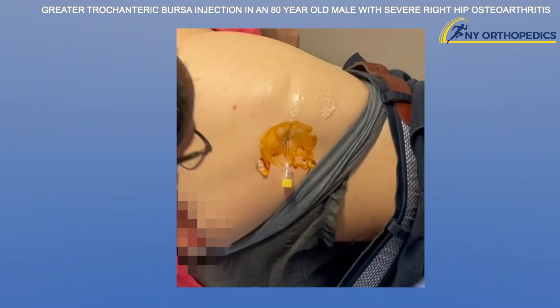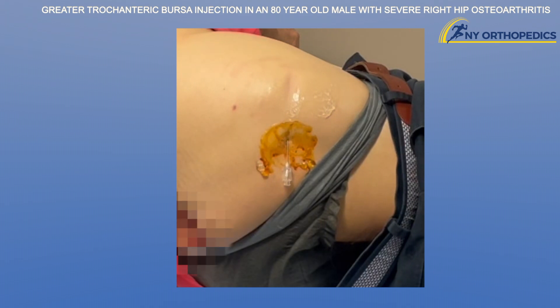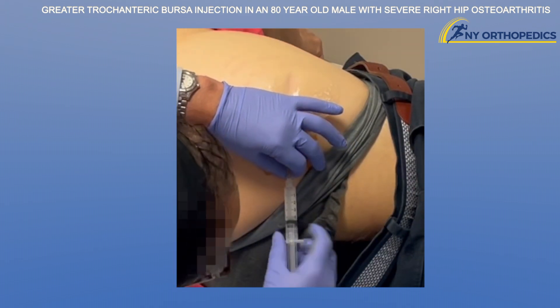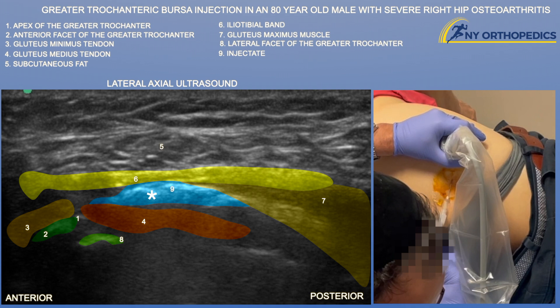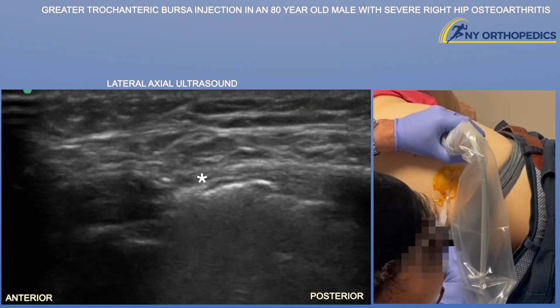It might be a little bit in the gluteus medius tendon itself. Now we're pulling out the stylet and attaching our cortisone — this is mostly saline, about three or four cc's of saline mixed with about 10 milligrams of triamcinolone. Here you can see that flash where you can see the injectate overlying the gluteus medius tendon and pushing up on the underbelly of the iliotibial band.